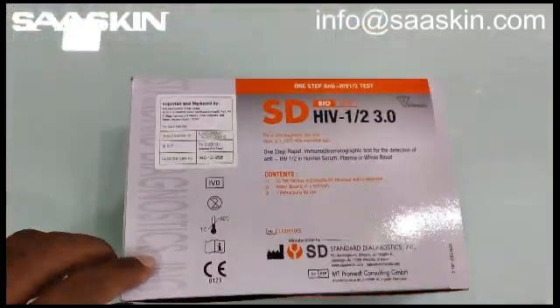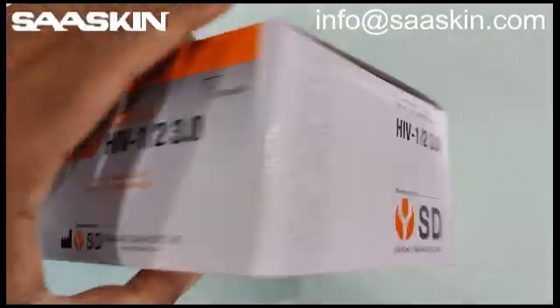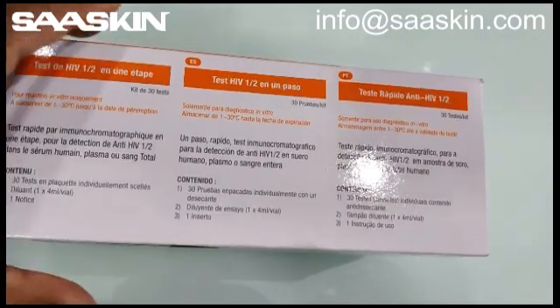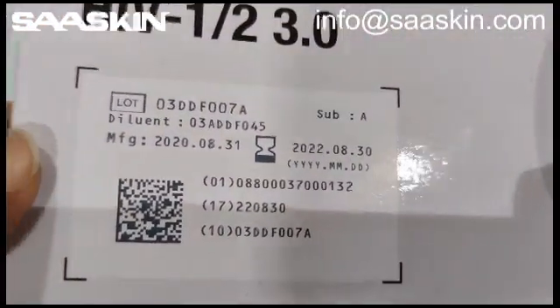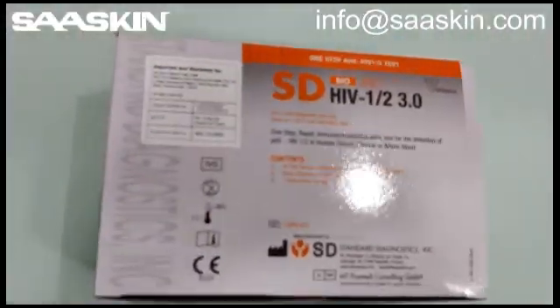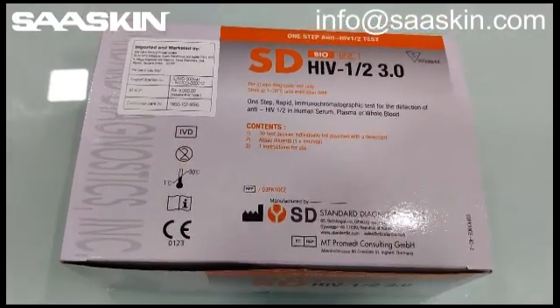This is the top view and this is the front view, and let me go to the sides. This is one side, this is the other side, and here is the other side. Typically these have a validity of 2 years. And there's the bottom side and here comes the top side again. This is a CE certified IVD product.